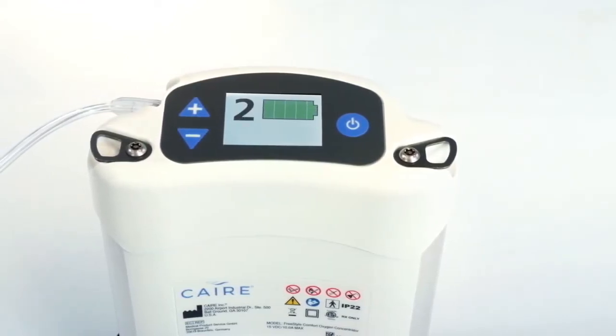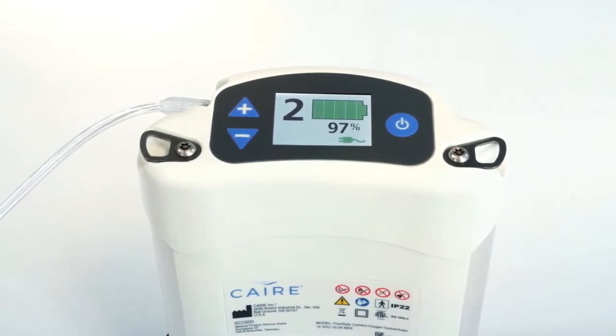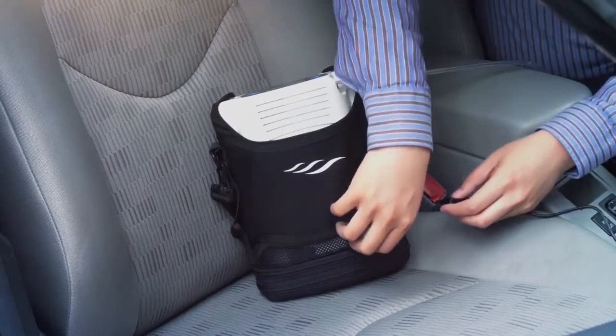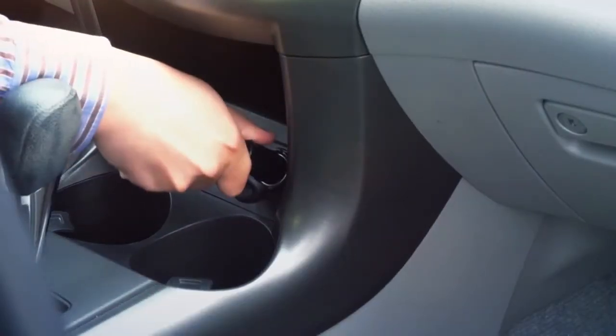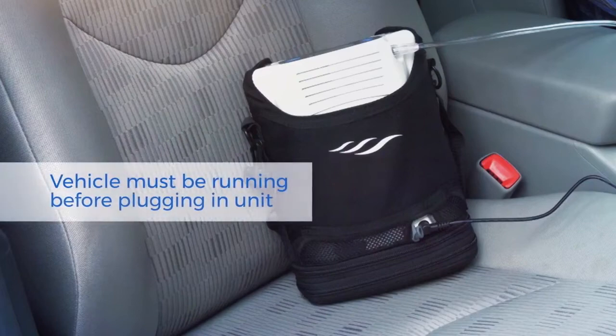The full-color display screen will show you the status of your battery charge with an easy-to-read graphic. To charge your battery pack using DC motor vehicle power, take the power connector and insert it into the power port by lifting the receptacle tab on the front of the Freestyle Comfort, then insert the power cord into your motor vehicle's accessory outlet. Be sure your battery is still installed in the unit and your vehicle is running before connecting the DC power cord.